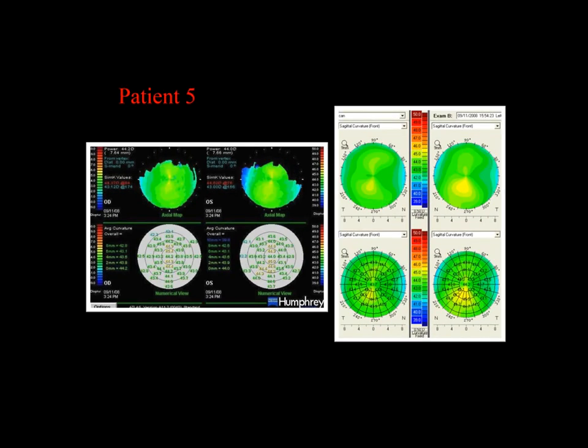Again, you'll see the poor coverage that you'll get compared to the Pentacam. So again, I personally don't really see the value of doing a Placido curvature map when the curvature maps, if anything, give you better coverage and more information from the Pentacam.